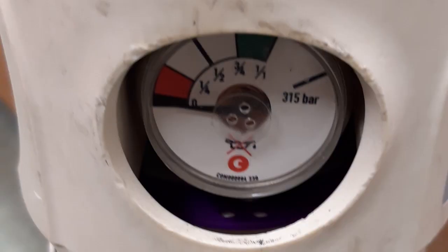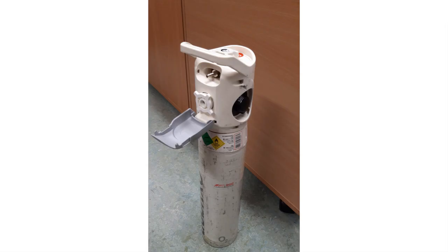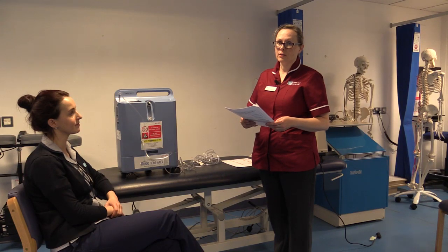There will be a gauge at the front of the cylinder which will enable you to see how much is left. If these need replaced, yourself or the family can telephone the same number that is on your blue machine to order replacements. Within the client's notes, there also will be a care plan for domiciliary care or support workers in assisting a service user with oxygen.